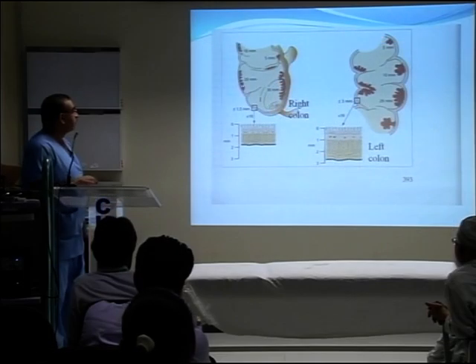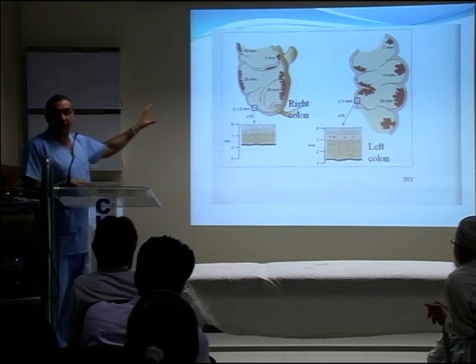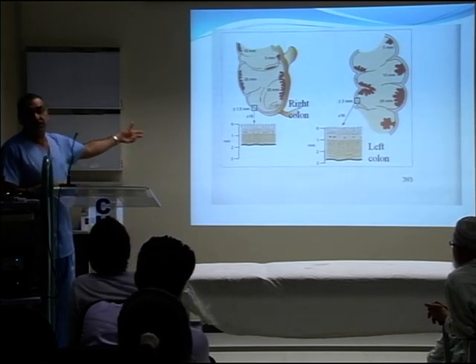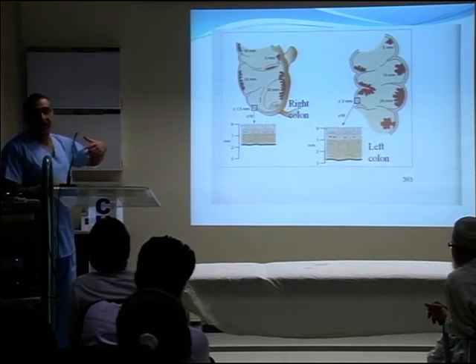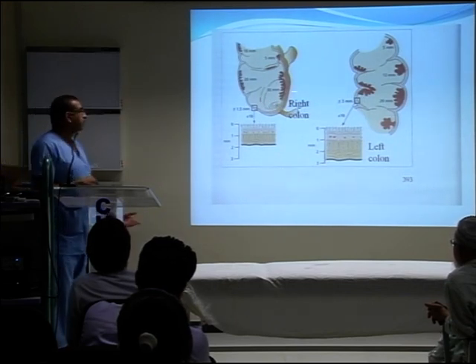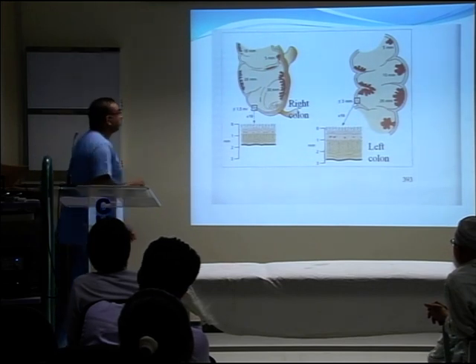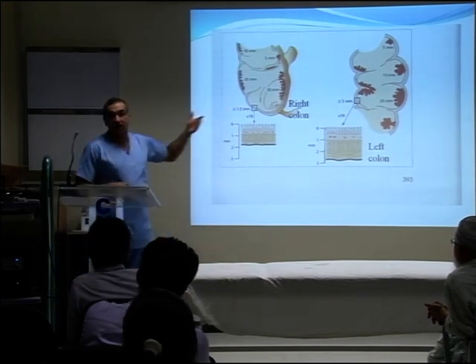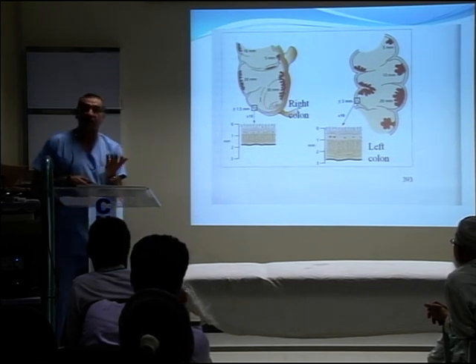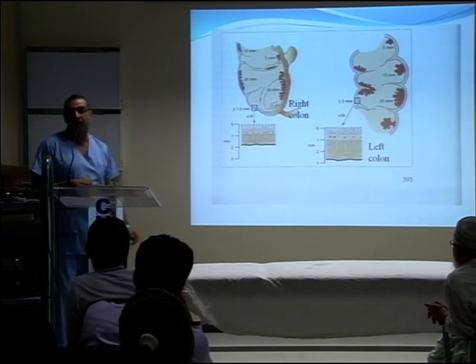Sometimes I've seen people who have carried out APC treatment for angiodysplasia in the right colon and perforated it. I mean, that's a real shame, because for such a minor, trivial thing, you cause a perforation. So number one, personally, I'm not very keen on doing APC over there. Even if I do it, then I inject some saline under the angiodysplastic lesion and fire the APC on top of that, and that gives it a bit of protection.